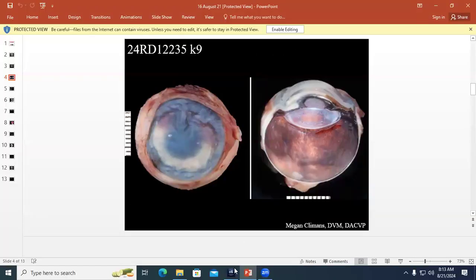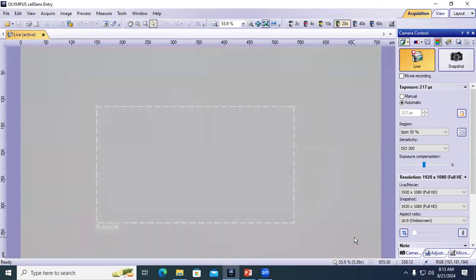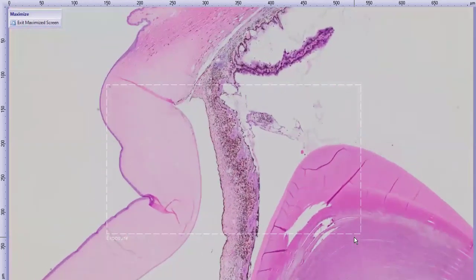Now let's take a look at the histology. If it seems like I'm ignoring important things, trust me, there's a method to my madness. Usually I sit next to you and ruin everything, but I'm keeping my mouth shut. I've learned not to chime in too early. I haven't learned yet. Megan likes the suspense. I like suspense. And the thing is, I also do frequently ignore the elephant in the room, not on purpose, and could use a good reminding.